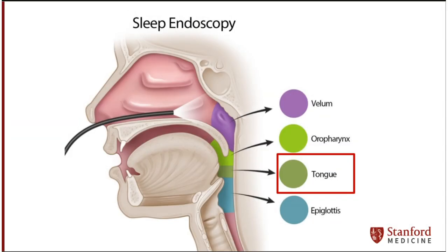Subsequently, the scope is passed to observe the tongue base and epiglottis. All observed findings are recorded and noted.